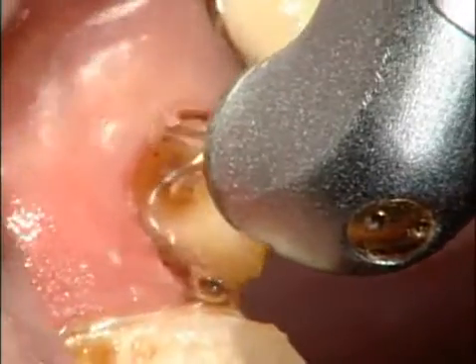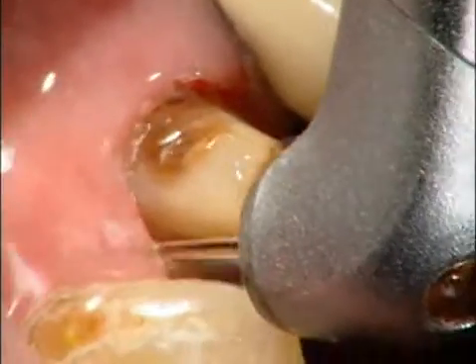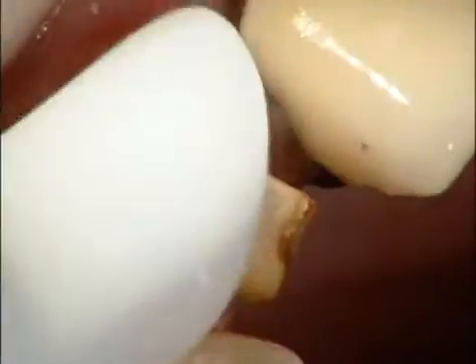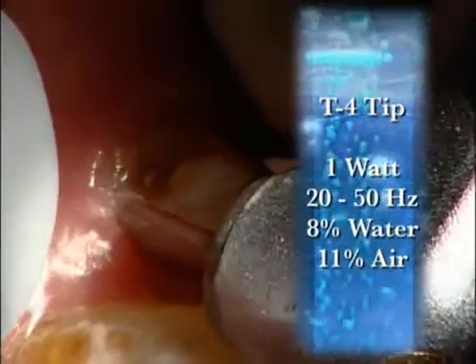And after I have my margins done, I will go in and trough around the tooth with a T4 tip at 1 watt, 8% water and 11% air. And you can do this from 20 to 50 hertz.